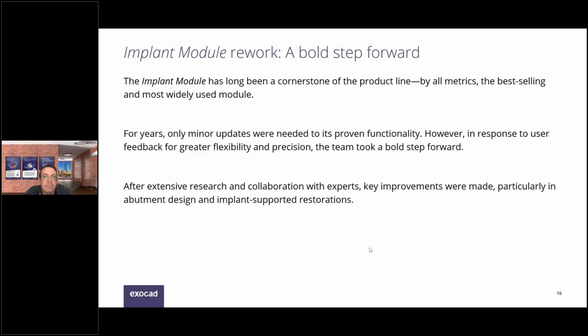A lot of these improvements are based on feedback from you guys, resellers and partners. All of that has been gone through, and key improvements were selected to implement in the software to make a really cool abutment design module now.